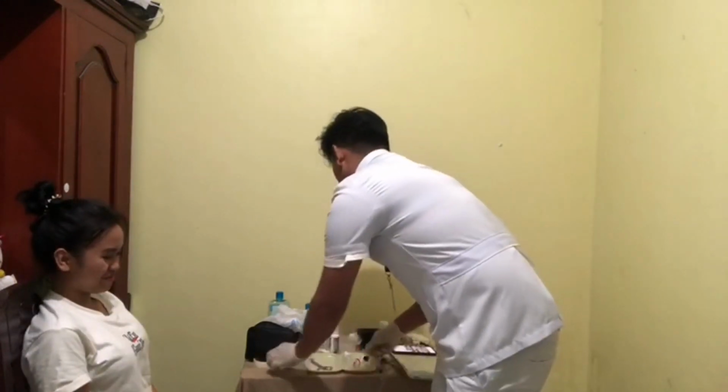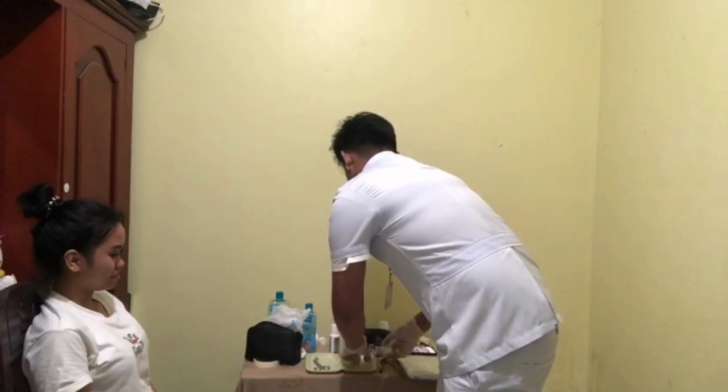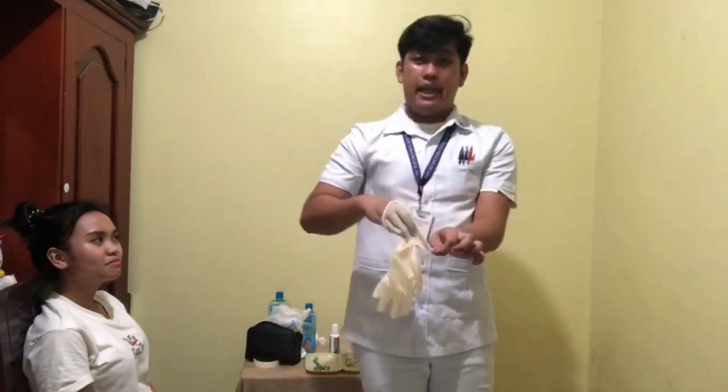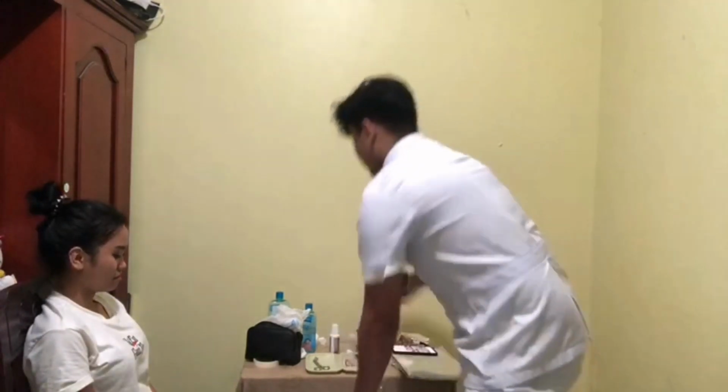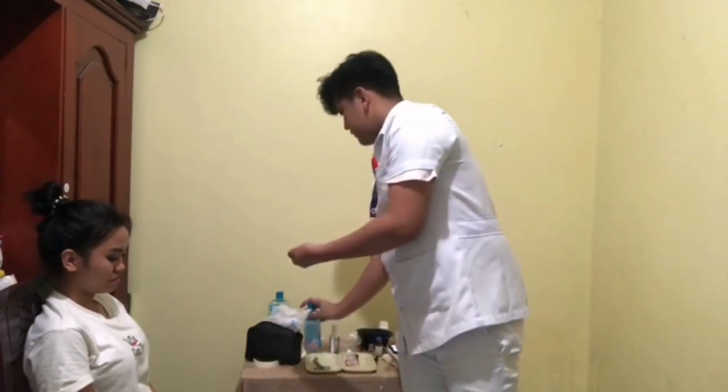I am going to do an aftercare on the equipment that I've been using, and then I am going to remove my gloves and perform hand hygiene. Discard. Then we'll assess the patient to see the effectiveness of the medication and whether they had a negative reaction to it.